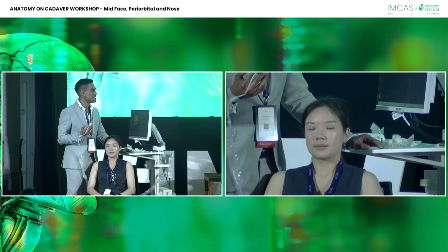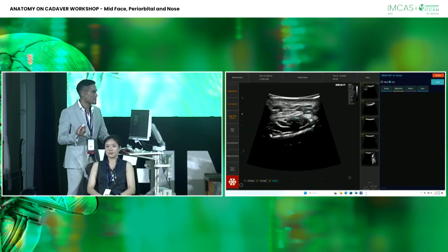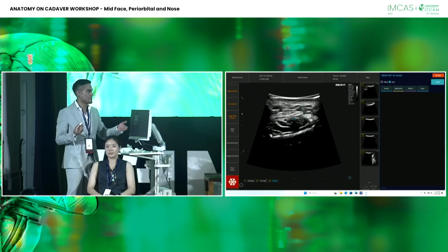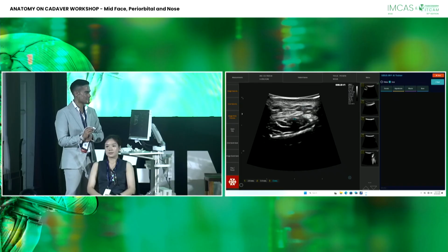For new ultrasound users, the trick might be just to be immediately pre-periosteal. Pre-periosteal. I prefer to be pre-periosteal. It's sort of an advanced issue, but it isn't, because everybody's injecting in this area. Everybody should know it. Thank you very much.